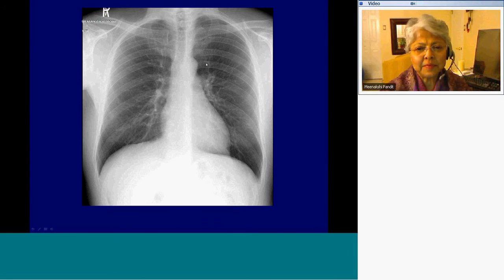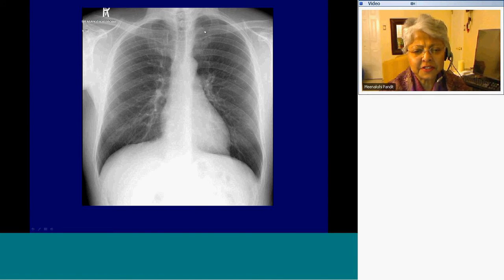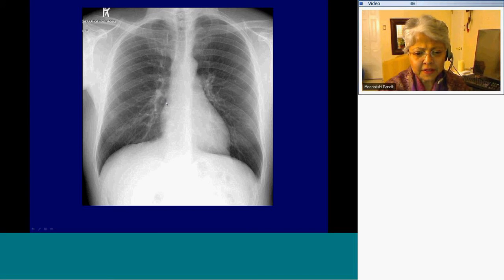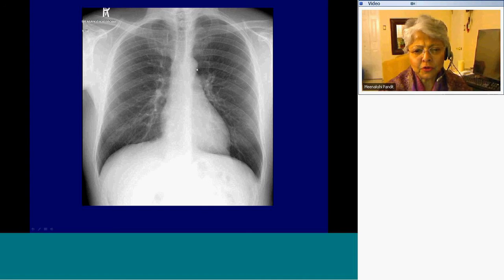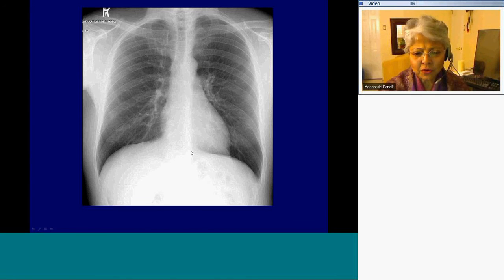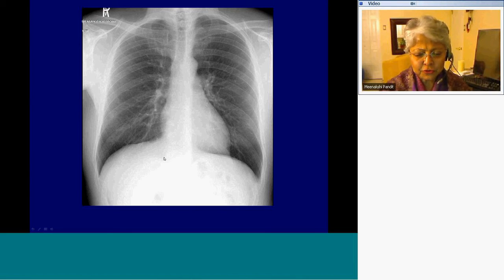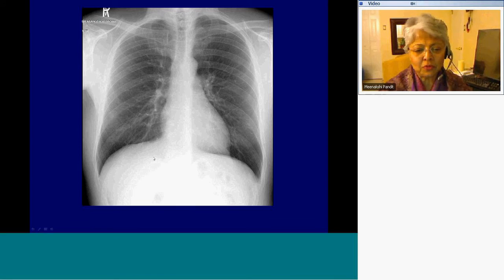Let me recap some of the lines and interfaces we discussed: the left subclavian artery interface, the paratracheal stripe, the azygous, the superior vena cava, the cavoatrial junction, the right heart border, the aortic arch, the AP window, the pulmonary artery, the aorta, and the azygoesophageal interface. These are two posterior segments in the paraspinal regions of roughly equal radiodensity.